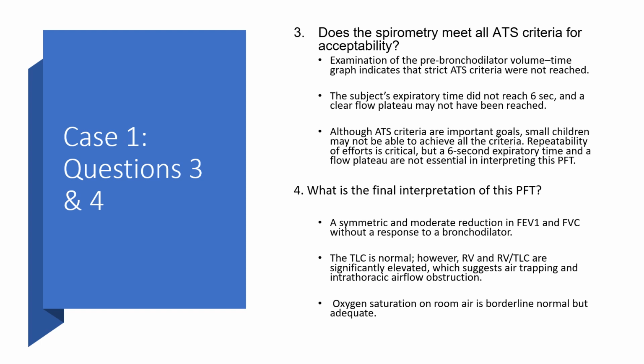The patient's oxygenation is adequate on room air. It's a bit borderline, but again, it is indeed adequate. So this is not surprising. What I will tell you, though, is for an 8-year-old with cystic fibrosis, it's a bit disconcerting. It suggests that they have significant impairment relative to their young age.